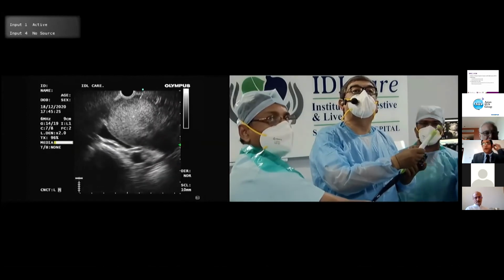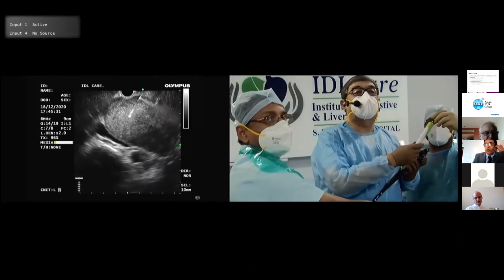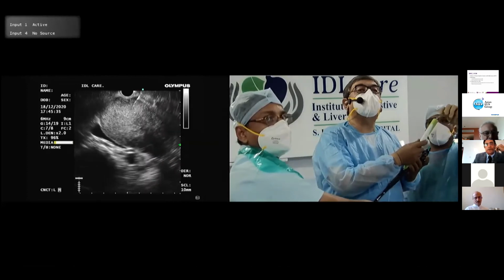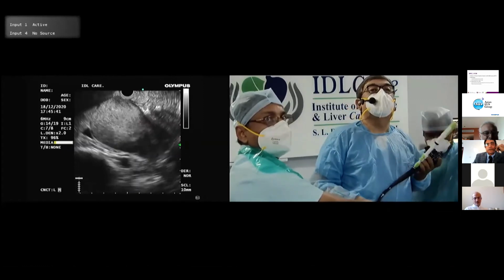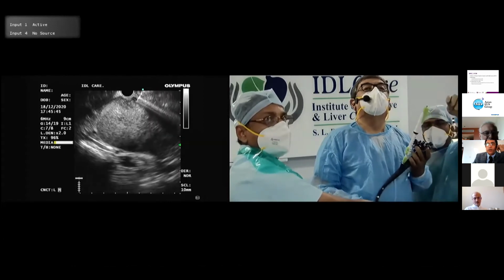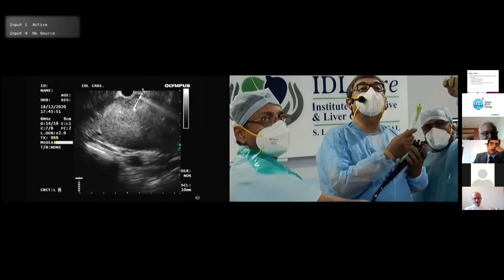I am in. What about locking the controls, sir? Some people lock, some people keep it loose. What's your policy on that? So, you know, locking the controls loses the subtle movement that you want. So I never do that. Even just before the puncture, you will not lock it? Never. Because I want my small movements.